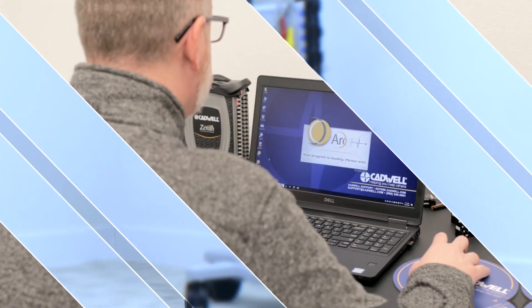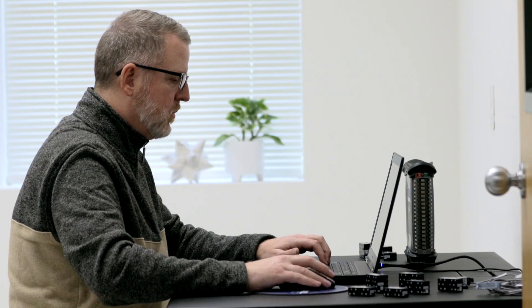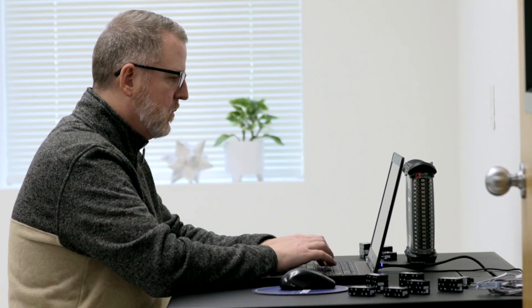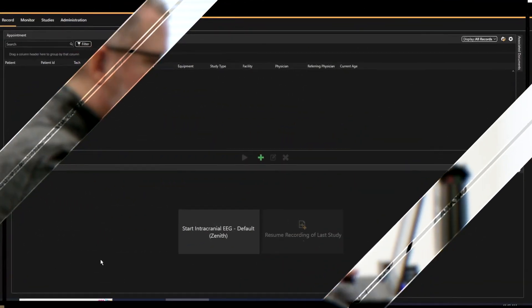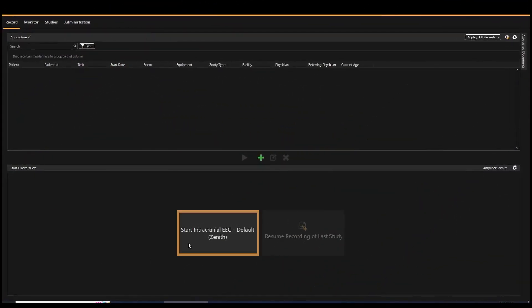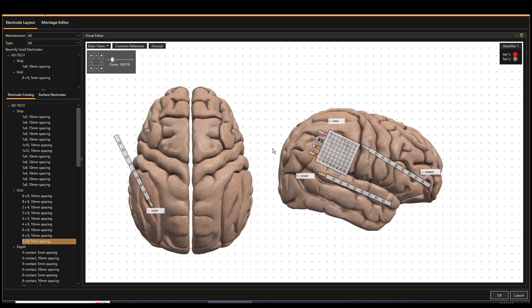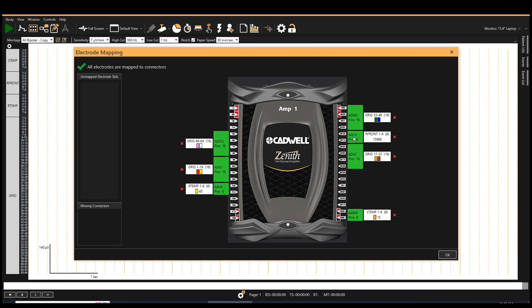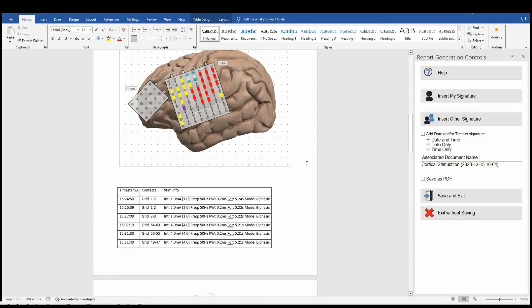ARC EEG software brings you smart tools for comprehensive intracranial EEG monitoring. It features simple operation, easy-to-interpret data, streamlined assessment tools, and a rich report generator.